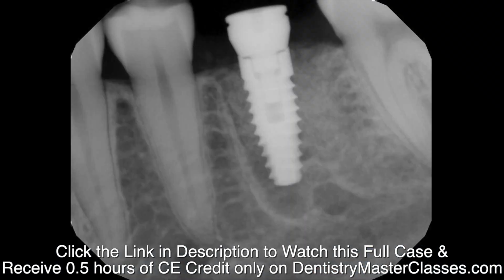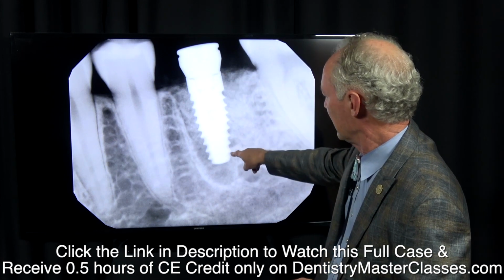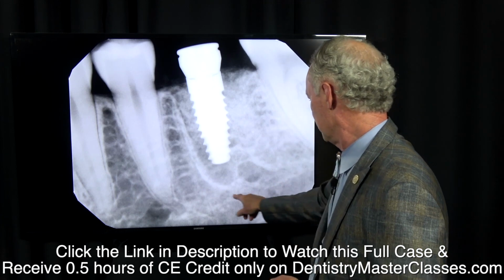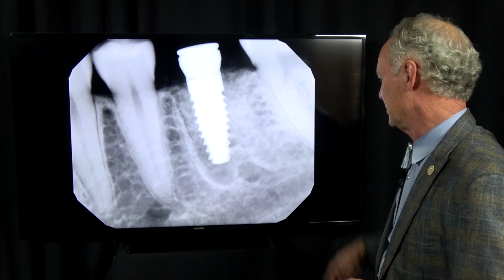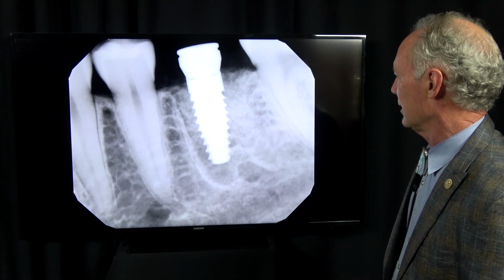So here's the implant. So see, we're about 12 millimeters, plenty of bone. Here's the inferior alveolar nerve down here, not close to that. You can see the nerve right there. There's the inferior alveolar nerve. So that's a good, safe distance from the nerve. The implant's nice and parallel.